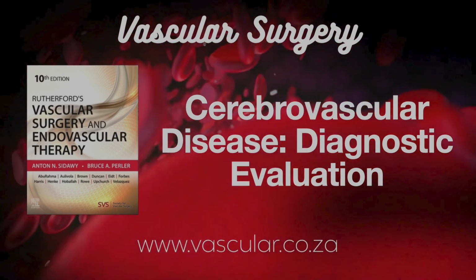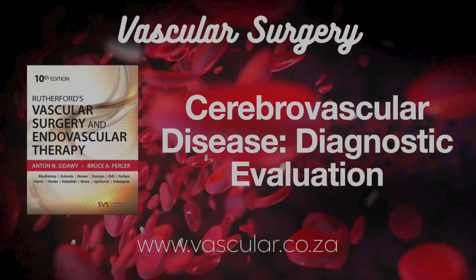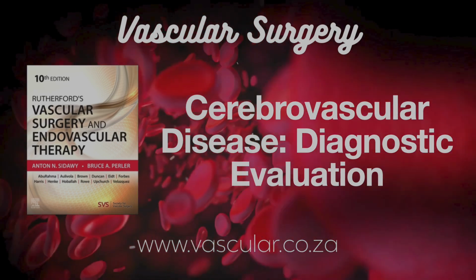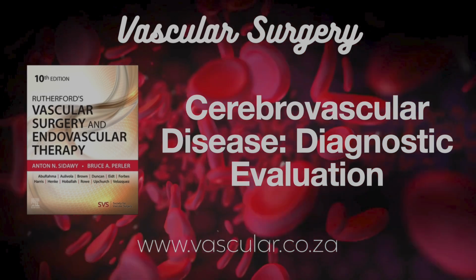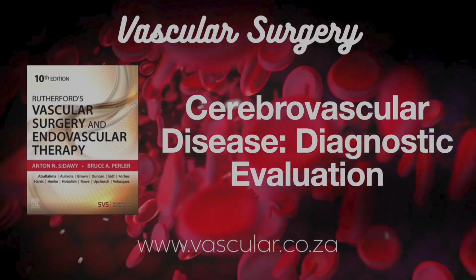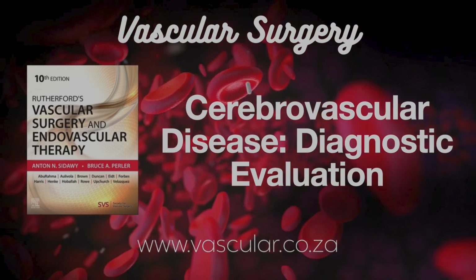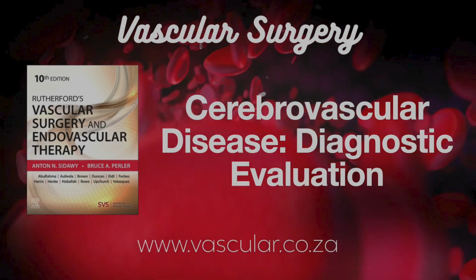And what about those vertebral arteries we mentioned? How does CTA fare there? CTA is excellent for vertebrals. Because it uses X-rays, it sees right through the bone that hides their origins from ultrasound. Big advantage. Huge. It shows their origins clearly, any tortuosity, meaning twists and turns, and we don't have those artifact problems that can sometimes affect DU at the vertebral origins.